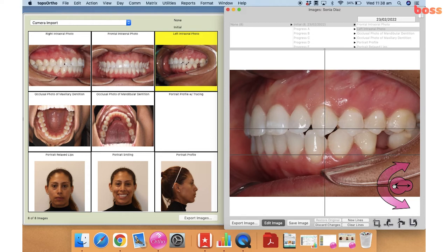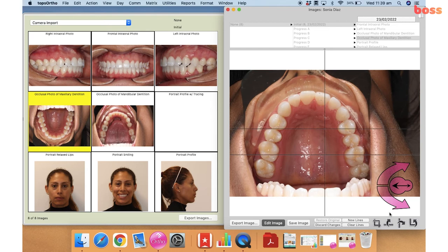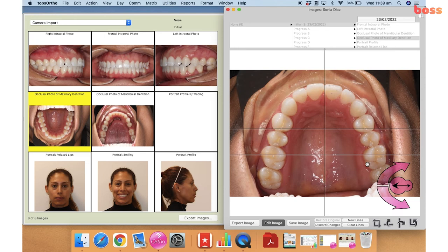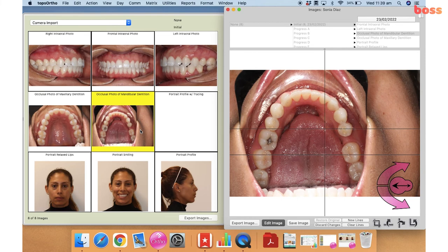Now when you're editing your pictures of the occlusal shots of the maxilla and the mandible, it's always important to remember that you have taken a picture of a mirror. So it's important to flip the image first so that we're looking at the photo as though we were looking in a patient's mouth — otherwise it's very easy to get confused between quadrant one and quadrant two. Here we're just editing the photo so that we don't see the actual top teeth anymore, and centering the photograph.